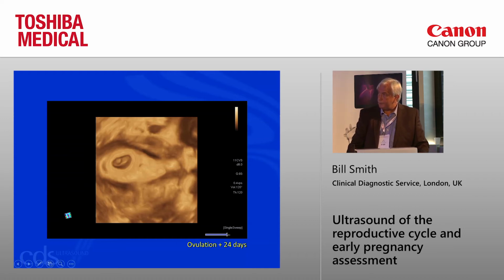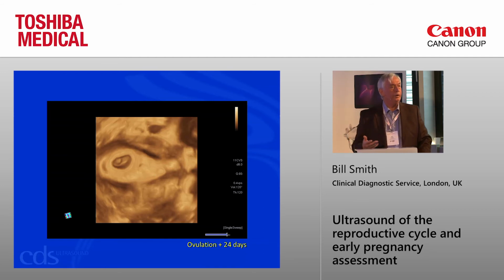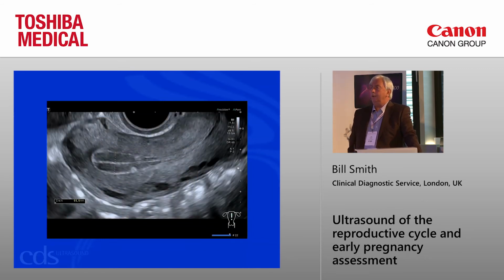But the significance here is, if we look at the decidua, again, with our rendered image, we can appreciate this glandular proliferation, which is crucial as far as early pregnancy is concerned. So if, as monitoring a patient, the patient comes along and there's an 11 millimeter endometrium, that doesn't necessarily tell us it's a good endometrium. At 11 millimeters, we should be seeing more glandular activity than we're seeing there. So this is very detailed observation.